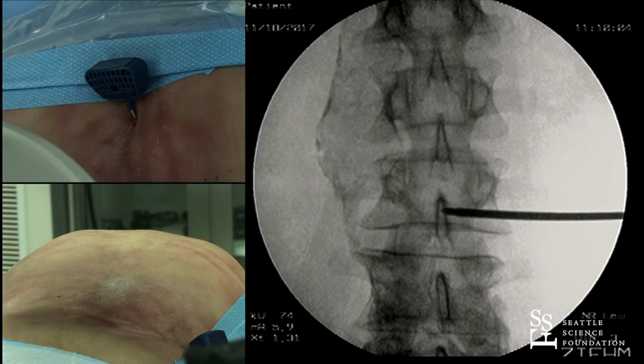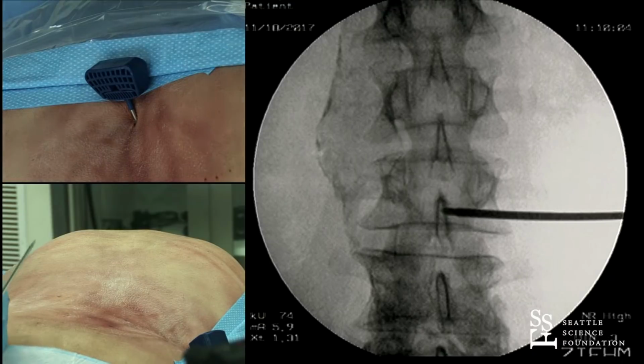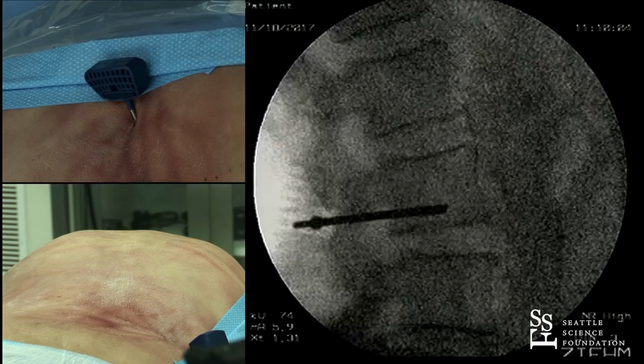Yes, that is my fastball. I really like the single bevel tip. You can have a better puncture of a curvilinear surface like the vertebral body with the multi-bevel, right? And then this one's a tri-bevel. They also have pencil point. The bi-bevel allows you to go one direction or the other, not necessarily very well against the bevel, but the unilateral direction of the bevel allows you to go in a single direction very sharply because the needle steers away from the face of the bevel.